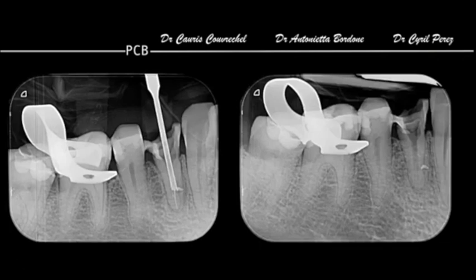So for a first case, they used a 1 millimeter, and this is the drill going to the head of the broken file. So once you get to the head of the broken file, it's easy to try to grab it.